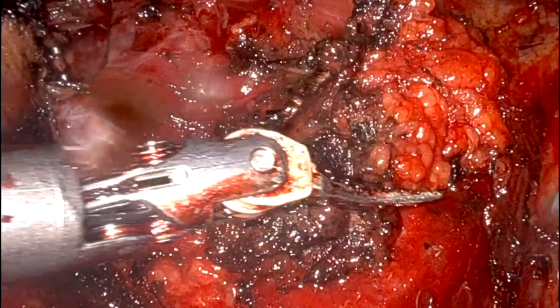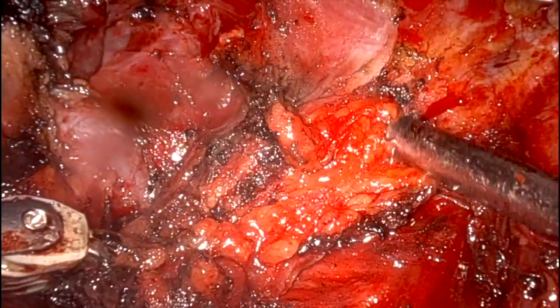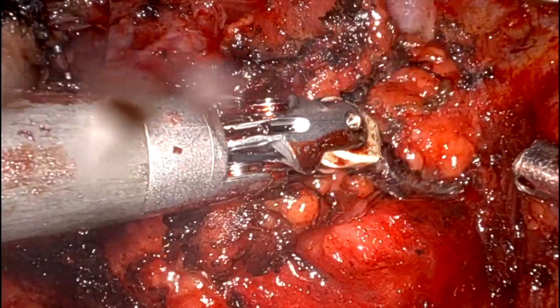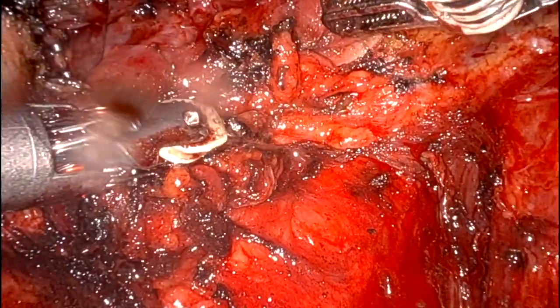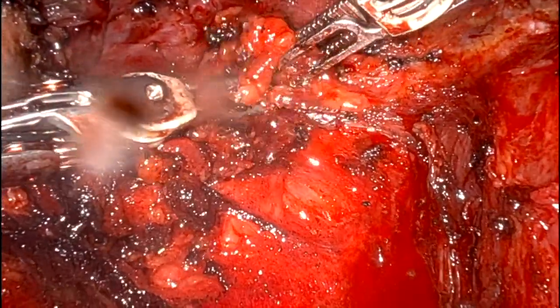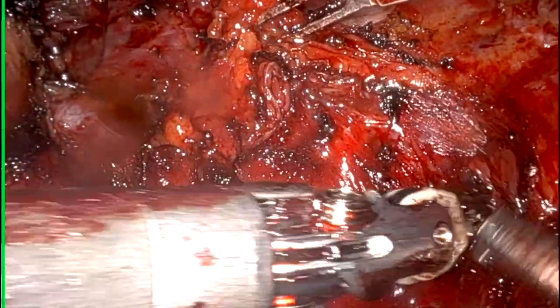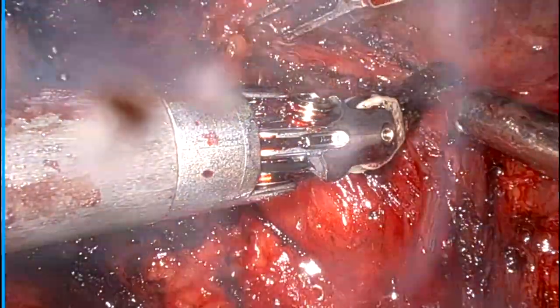Till now we were pushing our specimen down. Now I have taken my entire specimen up. Can you see? Yes. I am pulling the specimen up and start dissecting along sternocleidomastoid muscle again.